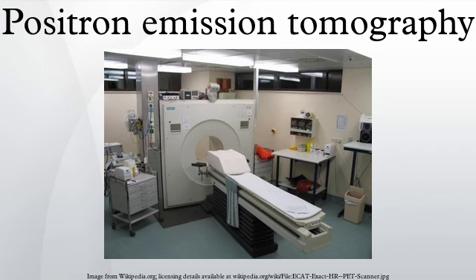Image reconstruction: the raw data collected by a PET scanner are a list of coincidence events representing near-simultaneous detection of annihilation photons by a pair of detectors. Each coincidence event represents a line in space connecting the two detectors along which the positron emission occurred. Modern systems with a higher time resolution also use a technique where they more precisely decide the difference in time between the detection of the two photons and can thus localize the point of origin of the annihilation event between the two detectors to within 10 cm.